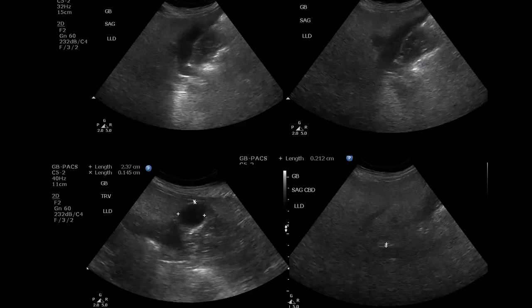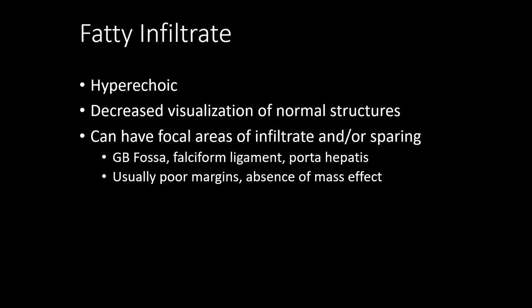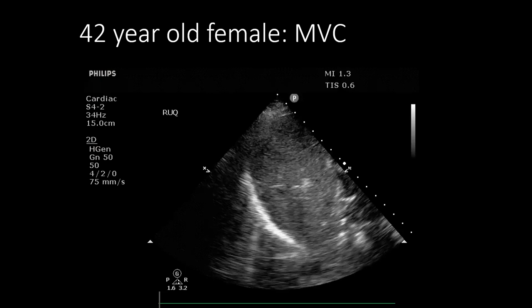With a really fatty liver, areas of sparing are common next to the gallbladder. It's also very hard to see internal structures — the gallbladder, vascular structures, portal triads — because the fatty tissue changes the speed of sound. Fatty infiltrate is typically hyperechoic, makes normal structures hard to see, and can have focal areas of infiltrate or sparing, typically in the gallbladder fossa near the falciform ligament and porta hepatis. These areas don't cause mass effect.